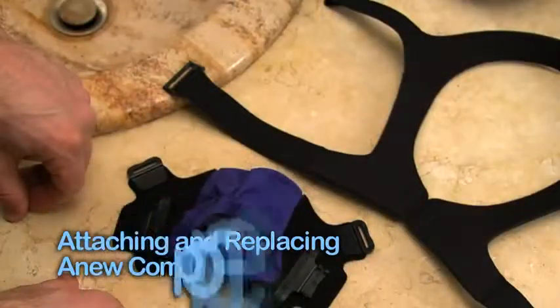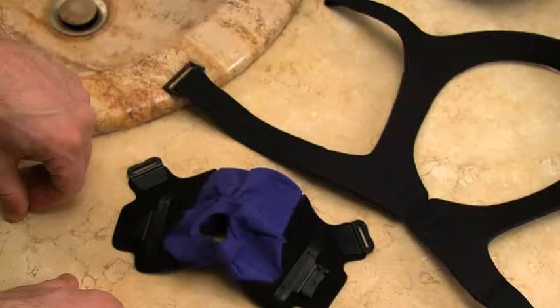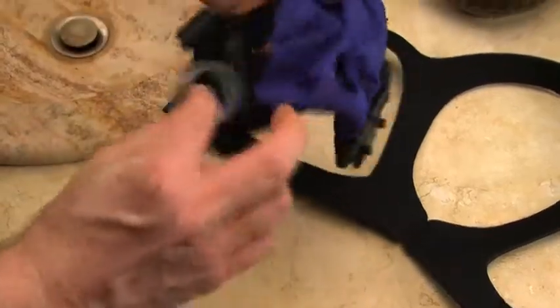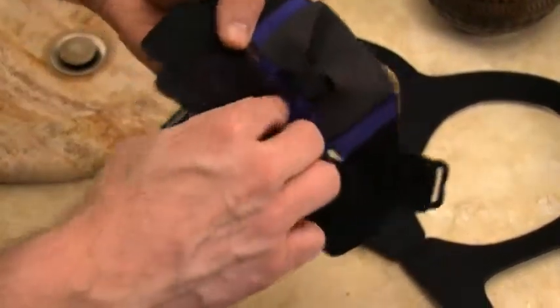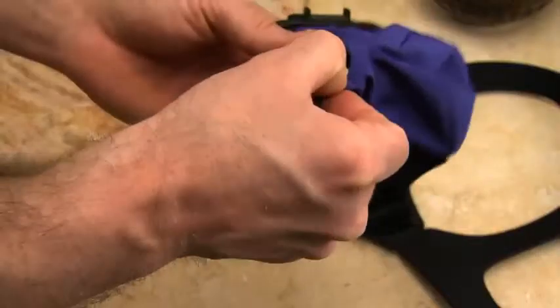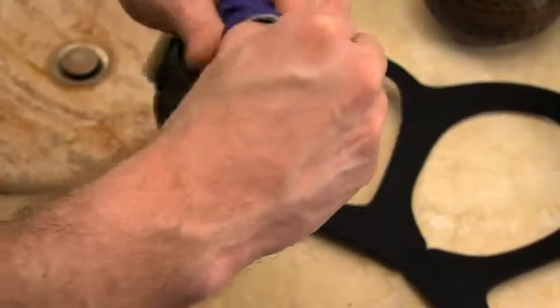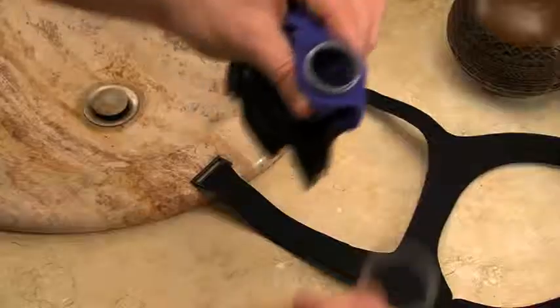Now we will demonstrate how to attach your 90-degree elbow AAV swivel to the mask. The same process is used for all sizes. First, direct the threaded piece through the inside of the oral interface and out the hole in the front of the mask. Second, place the washer over the threads to ensure that the fabric does not ride up onto the threads.